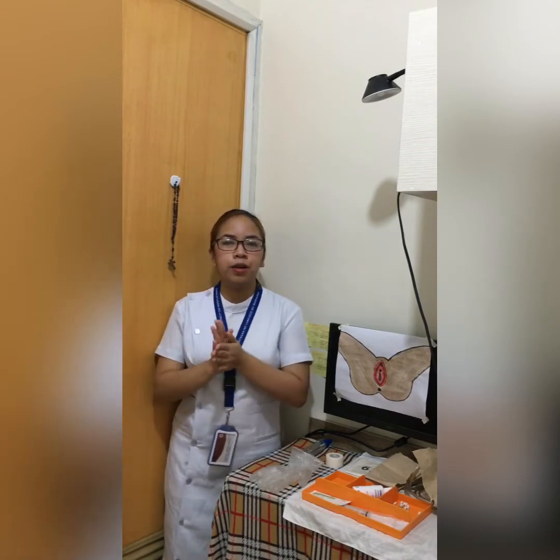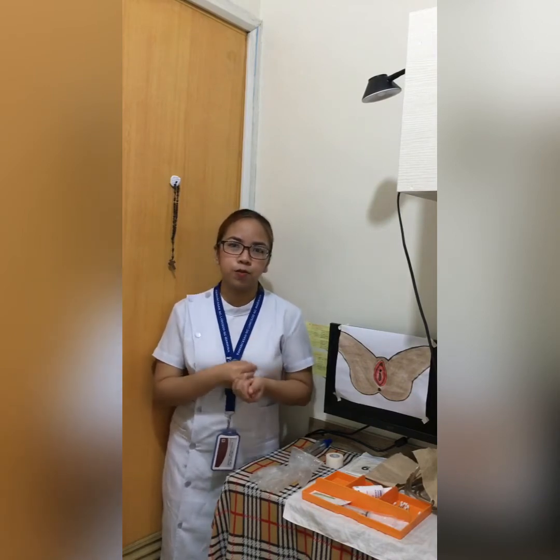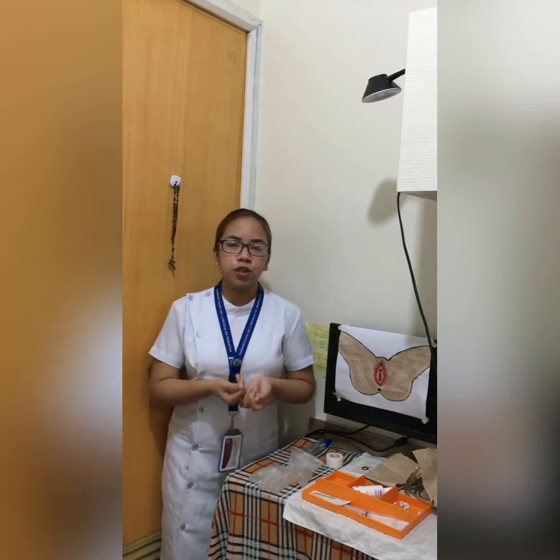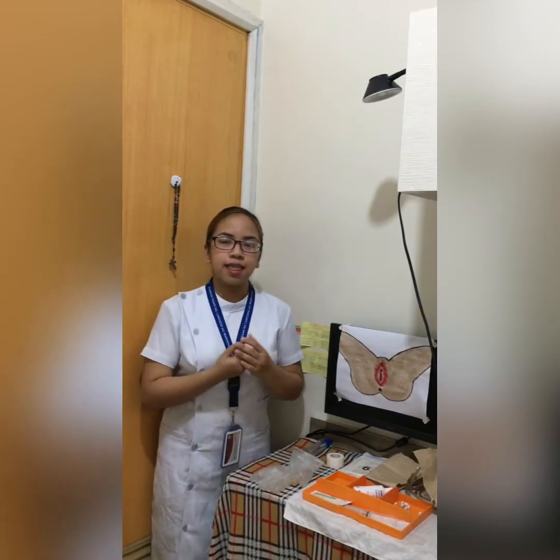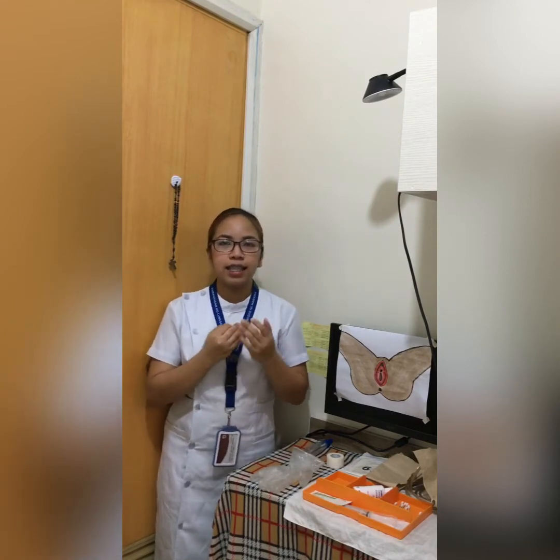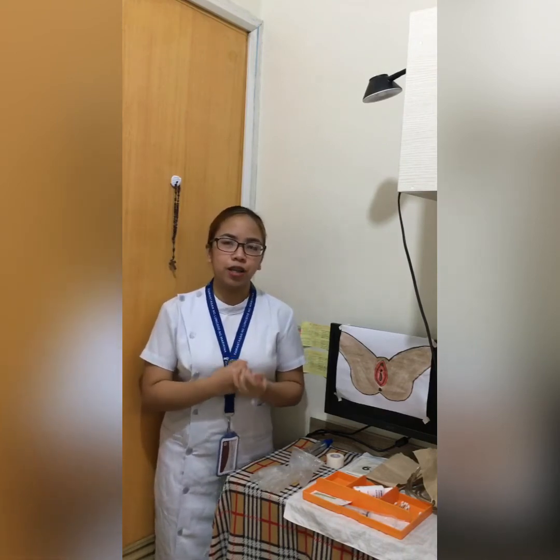So moving forward, we have to assess the client's need for catheterization. Then we have to review the medical record of the client, to see if there is any medical or pathological condition that may impair the passage of the catheter. Then we also have to look for any record of allergies. Then identify the client's gender and age. And last is to verify the doctor's order.